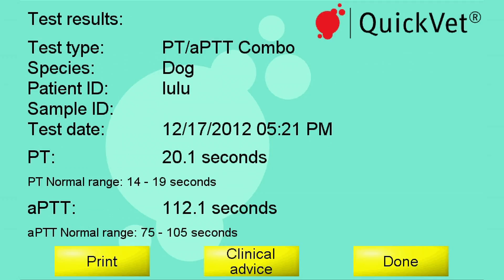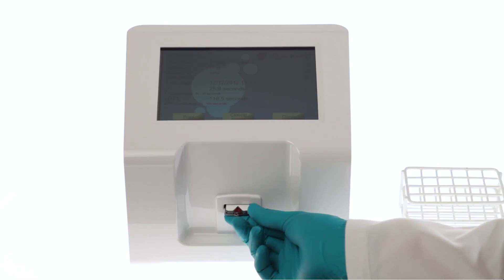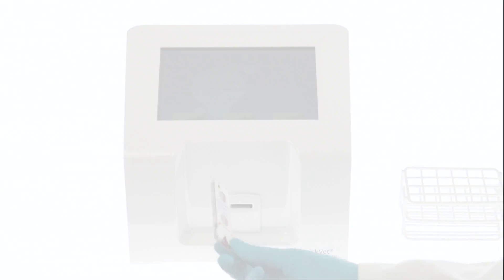Or go back to the menu screen. Under history, you can see up to 1,000 samples you've previously measured. Remove the used cartridge from the analyzer and discard it.